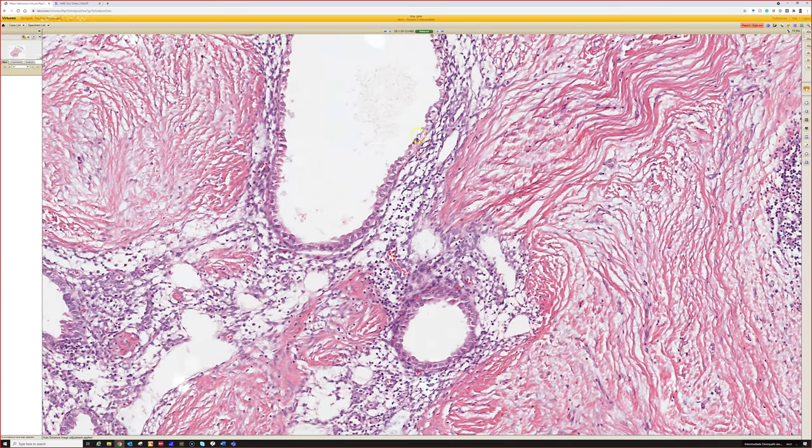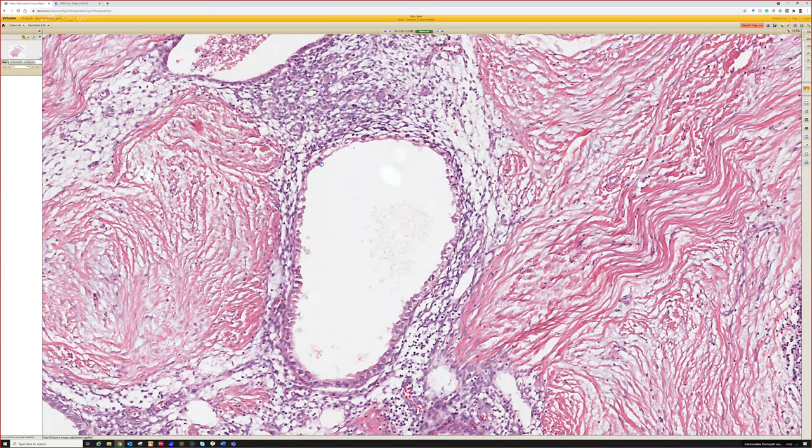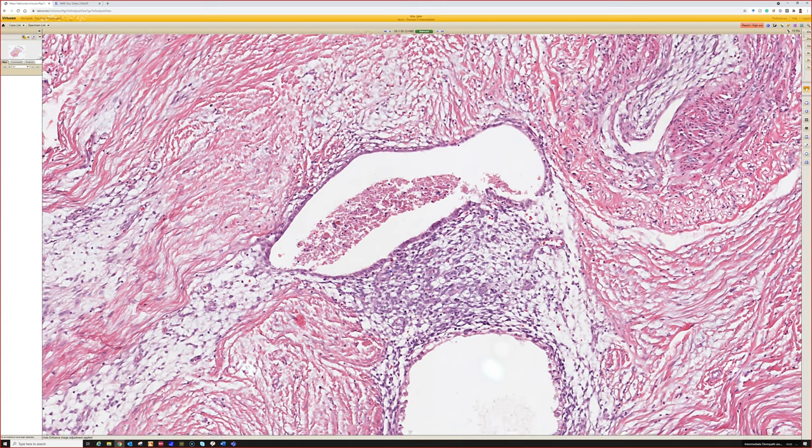But the key is that not only do we see these glands lined by a double layer of cuboidal to columnar type cells, a lot of times, or maybe it's not always double, I can't remember. And the features of the cells can range a little bit. I think that often has something to do with where in the menstrual cycle the woman is, because just like endometrium in the uterus changes with the different levels of hormones throughout the cycle, the same thing happens with the endometrial glands in endometriosis.